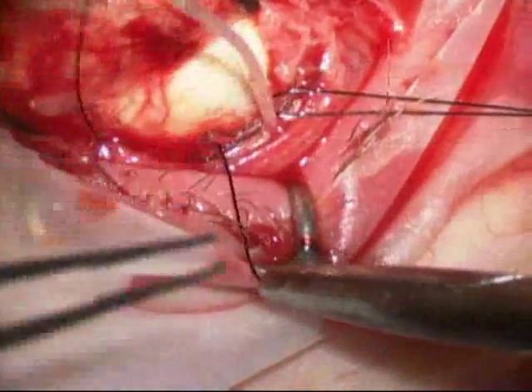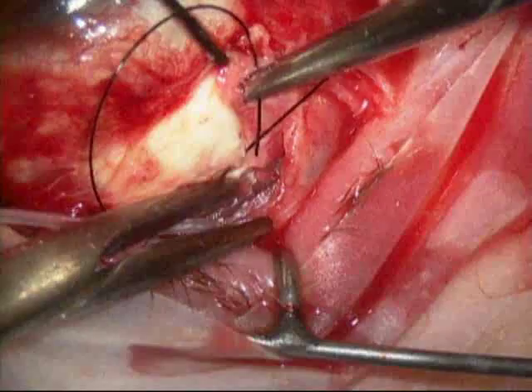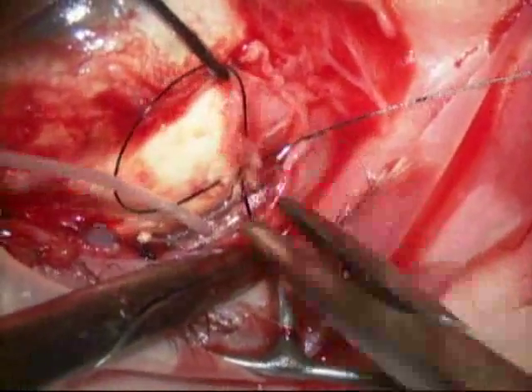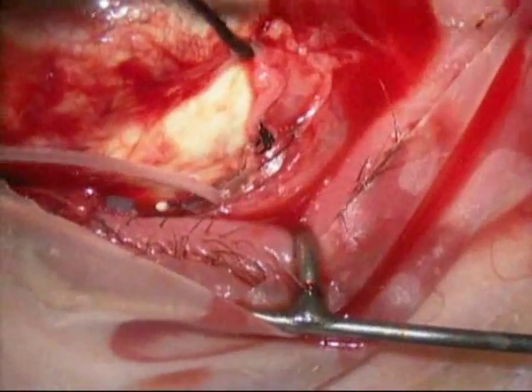Here you can see the AMED valve just inserted next to the globe — the little tube is sticking off the top of the AMED valve plate. Those two black sutures are used to secure the AMED valve to the globe, and then the valve tucks back right along the side of the sclera.